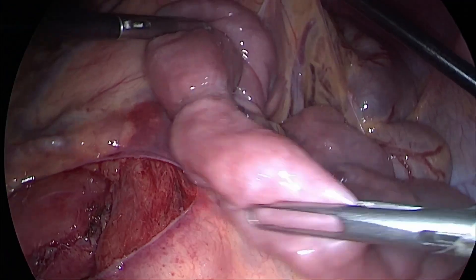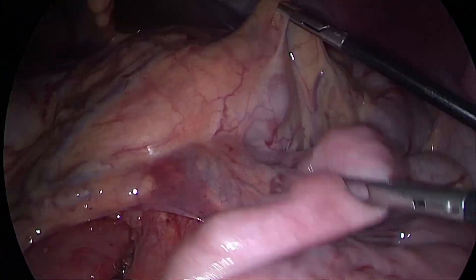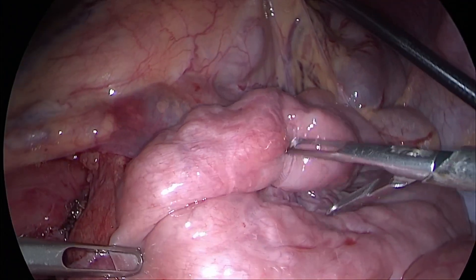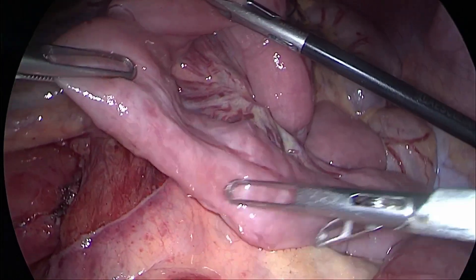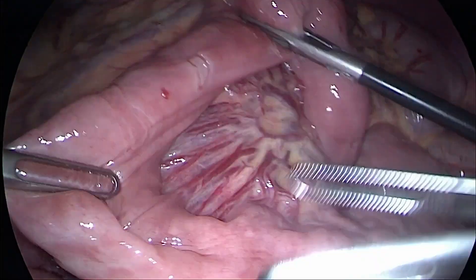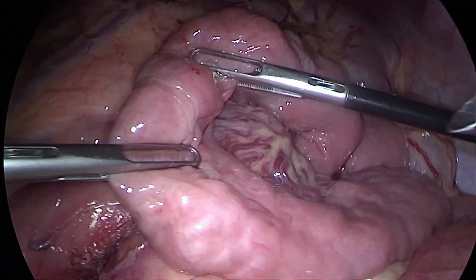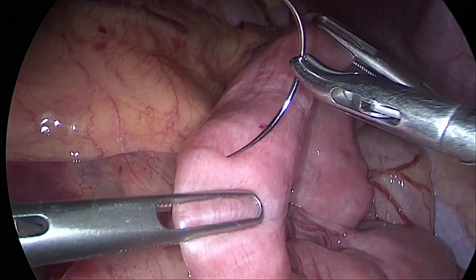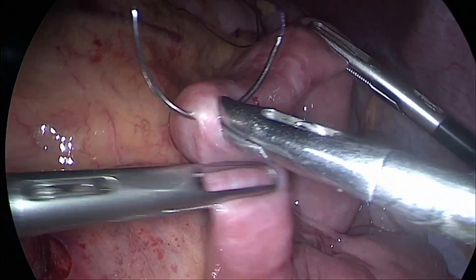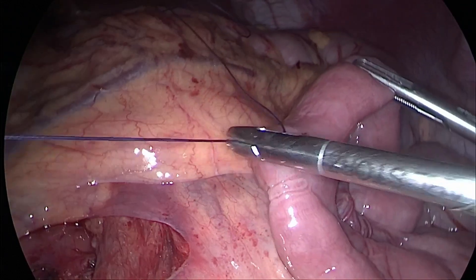The duodenum from the DJ flexure is brought anterior to the superior mesenteric vessels and a tension-free side-to-side duodenojejunostomy is performed.